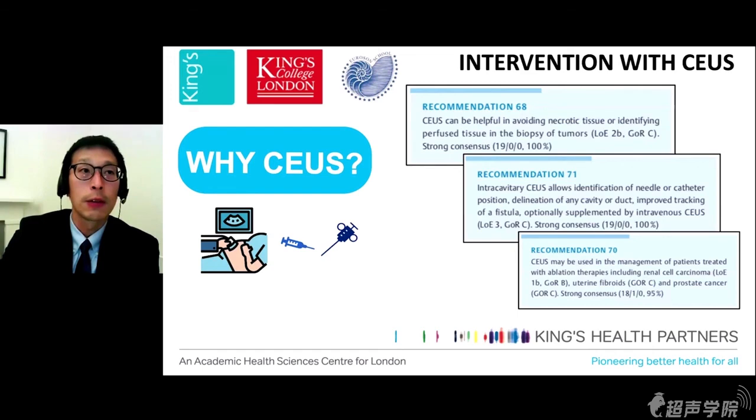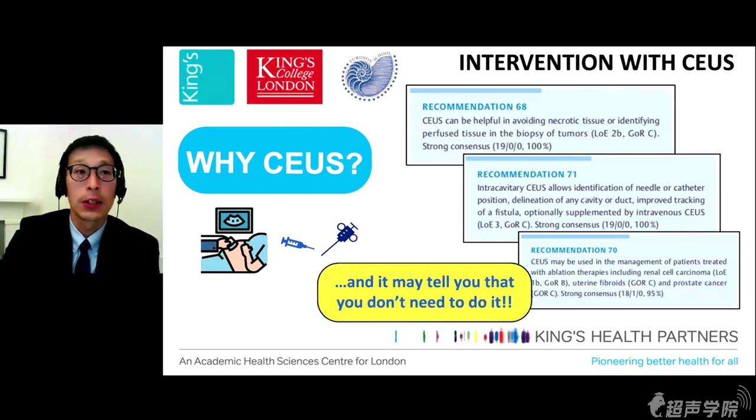So I just want to conclude by saying that with the addition of contrast agent, we can perform contrast enhanced ultrasound with added benefit in biopsy, in drainage, and also in management of ablations. But even before this, contrast enhanced ultrasound may tell you that you don't need to do any of these procedures.